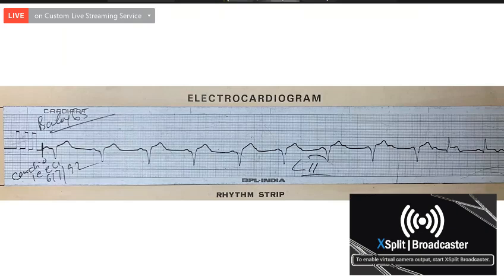Because if we see, 1, 2, 3, 4, 5, from the fifth beat onwards, at the end of the T wave, one P wave was there. And again, the next beat also at the end of the T wave, one P. And the next beat also again at the end of the T wave, one P. You are mostly right.